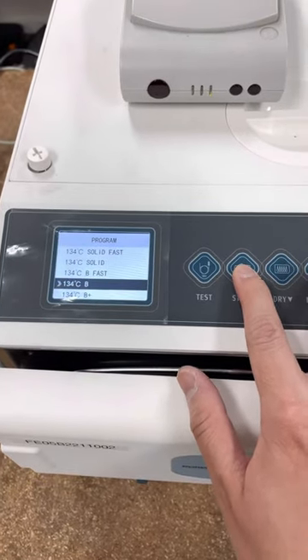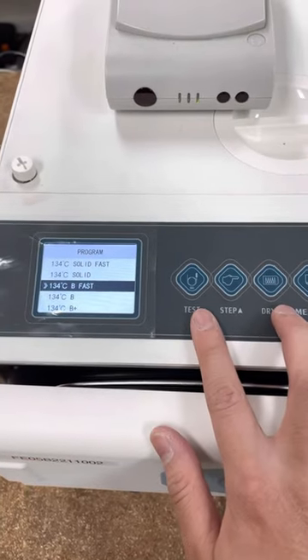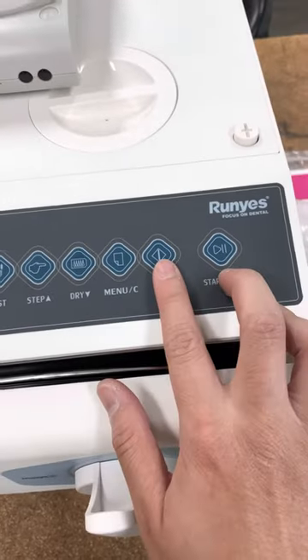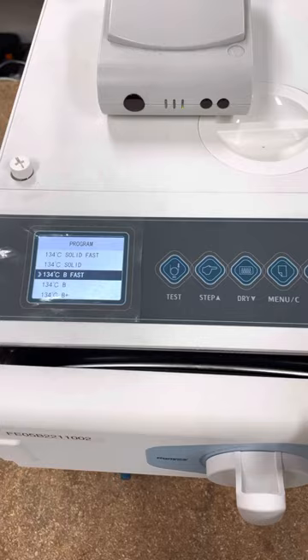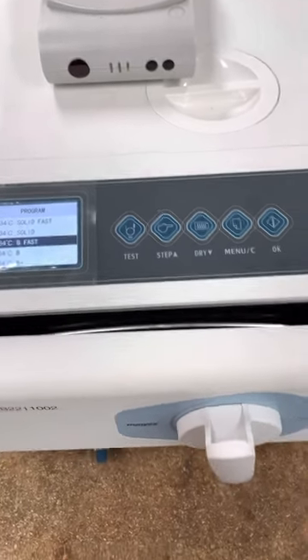To show you how the cycle is run, say for example if you click on 134 degrees B fast, you click on OK and start and you'll be able to run the cycle. Before we do that, I'll just quickly show you how to open and close the door.